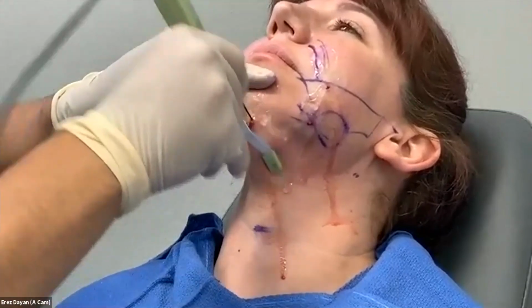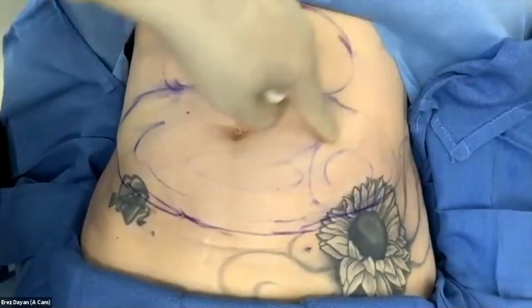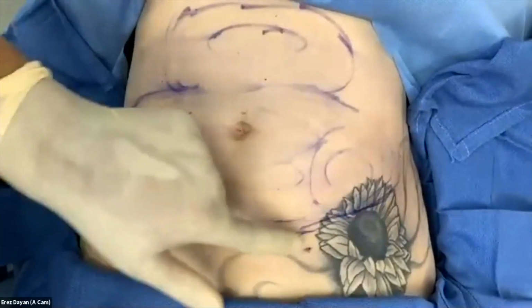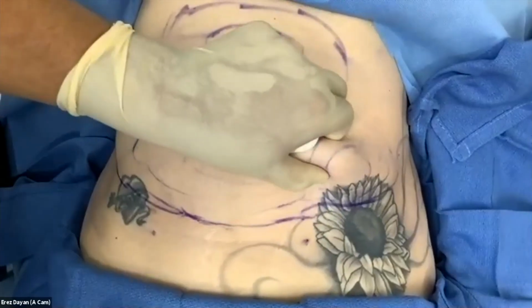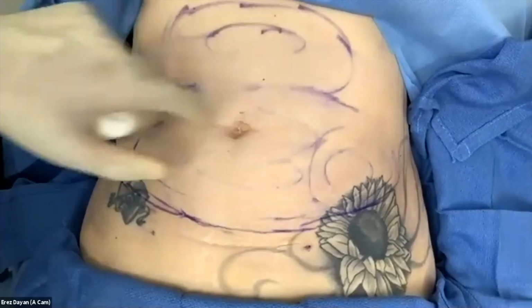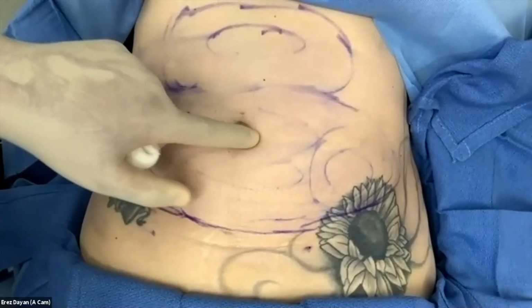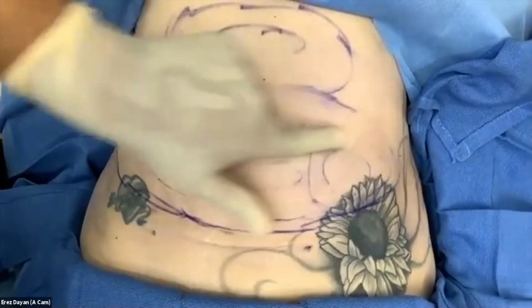So this is our patient's abdomen. She has a little bit of fullness here and a little bit of a depression here. So it's kind of a tough case because you want to get this down, but you want to make sure after 5 kids that she kind of tightens up. So what I'm going to do here is actually go periumbilical. We're going to do radio frequency and then lipo to get this down.